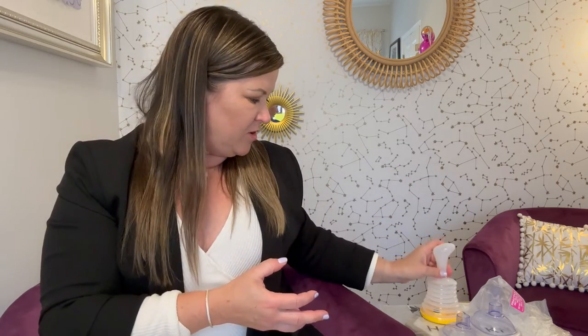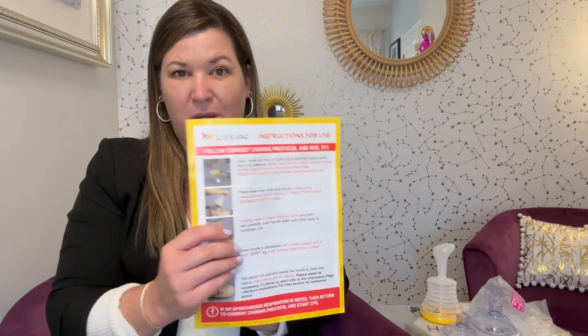Feel free to let me know if you have any questions, but of course always consult with your own doctor. Make sure to follow proper choking protocol — in the event of an emergency, always call 911 or have someone call 911 first. But I just wanted to show you the Life Back as an option to have in your home to keep your friends and family safe.